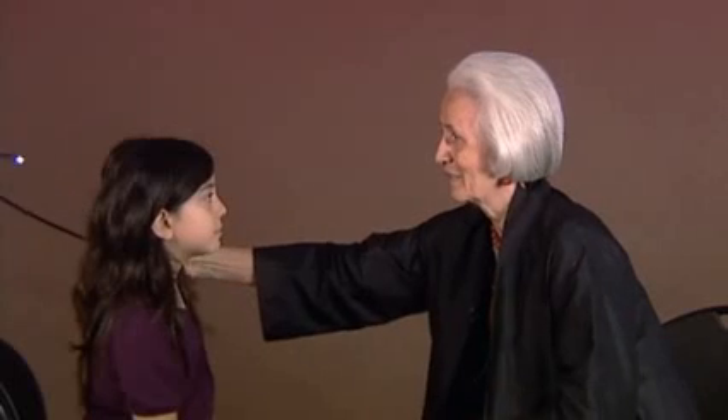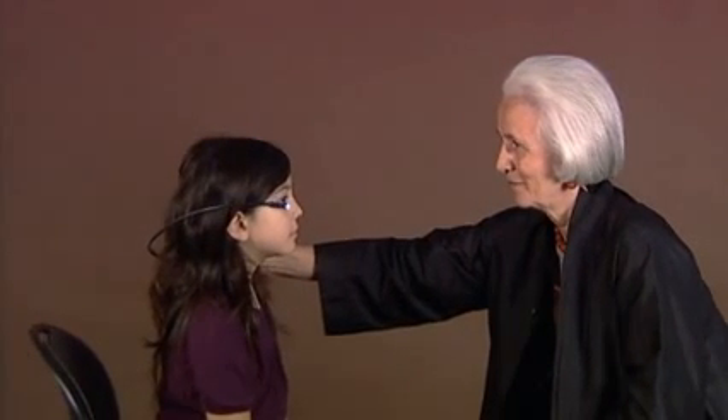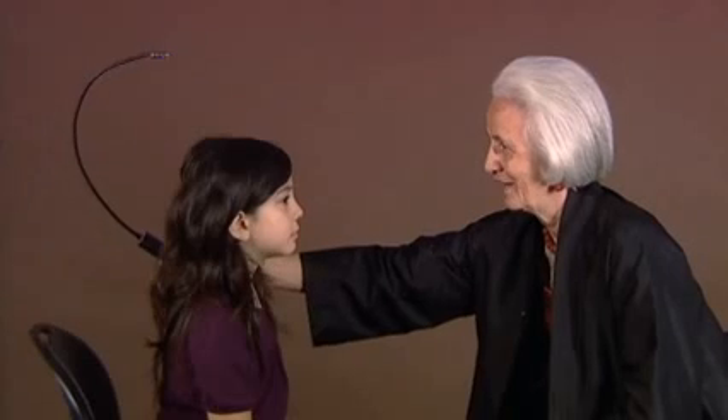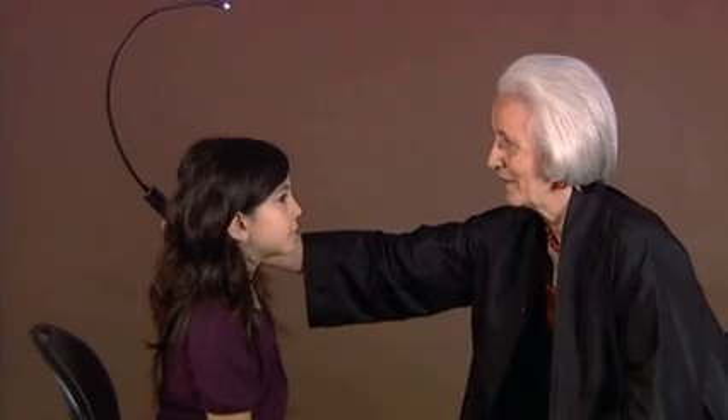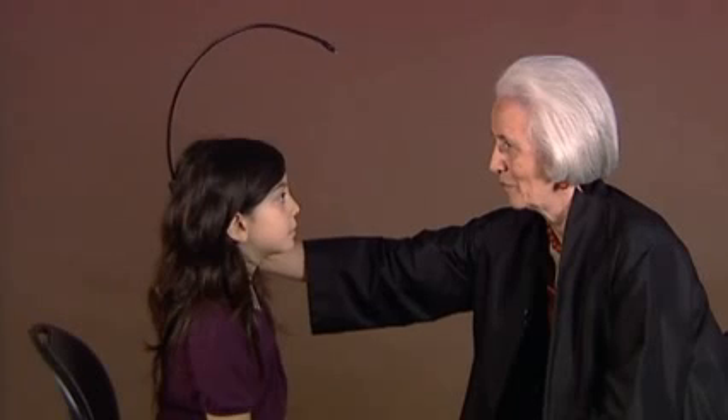Whenever you see the light coming somewhere, you can look at it. There it came. And now it's hiding. Look on my nose, and then tell me when you see it.